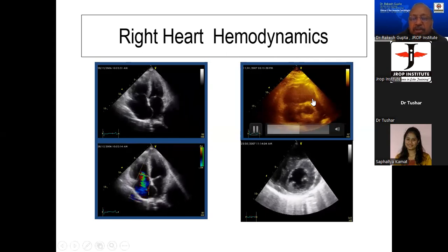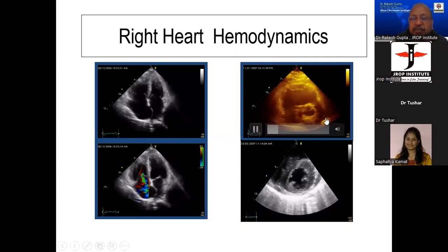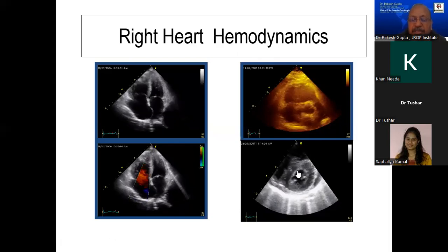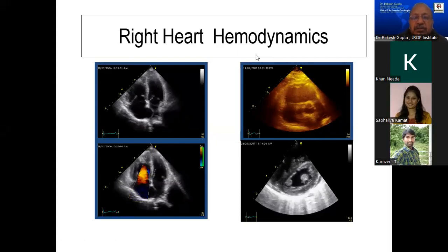On top of that, in short axis view, at the level of the aorta, RA is reasonably normal, but RV is hugely dilated and there is presence of a thrombus at the bifurcation of the pulmonary artery. And importantly, in the parasternal short axis view of papillary muscles, the septum becomes D-shaped with every systolic contraction.